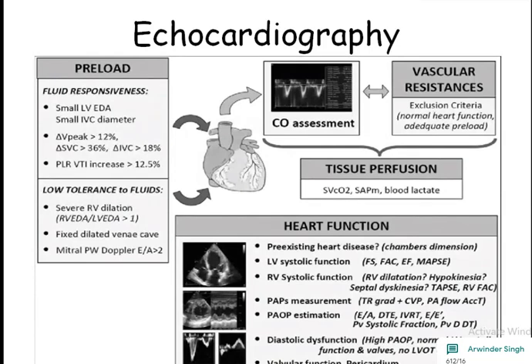With the help of echocardiography, you can assess the intravascular volume status of the patient, whether he is in hypovolemia or fluid overload. You can assess the fluid responsiveness. This slide has given you a brief overview of what all you can assess with echocardiography. You can learn all the details later, but I will tell you just in brief.